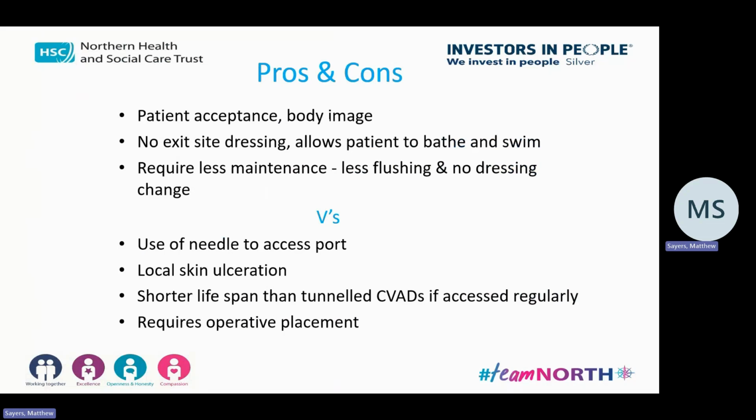But you do still need to puncture through the skin to access the port, so you still do have the children crying sometimes when you're accessing it, which can lead to that little local skin ulceration. And they tend to have a shorter lifespan than tunneled. And of course, it requires a general anaesthetic and operation for it to be placed.